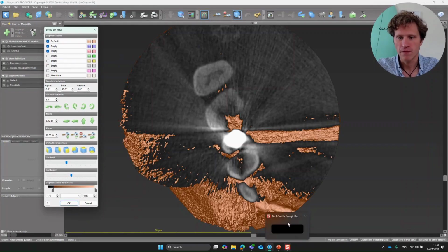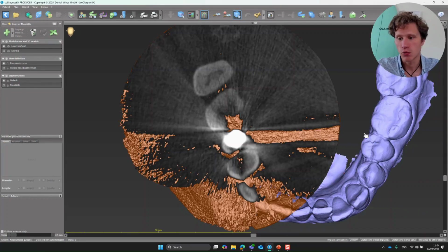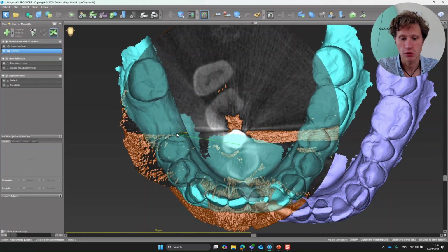What do we have? We have this area, but we put the patient just in a quadrant. If your whole protocol is the same, you will not cut your dose in a quadrant. The dose the patient receives will be the same. So what happens if we put the patient like this? This is our mandible, and we actually align this mandible with the quadrant. But what happens if we move our patient a little bit like this?